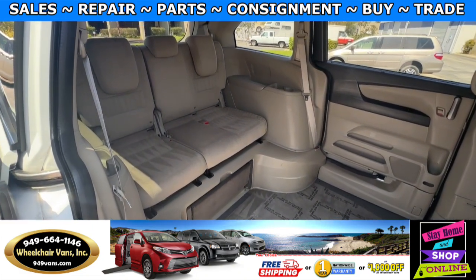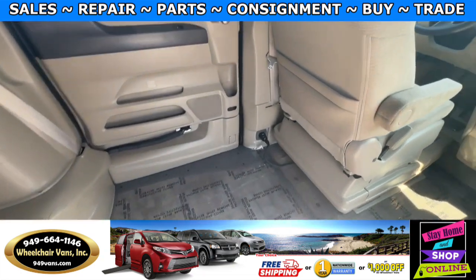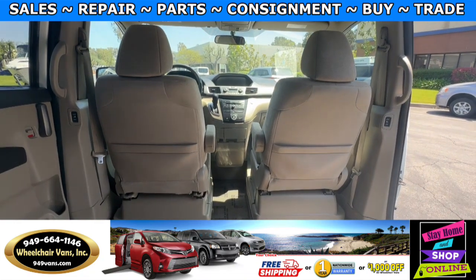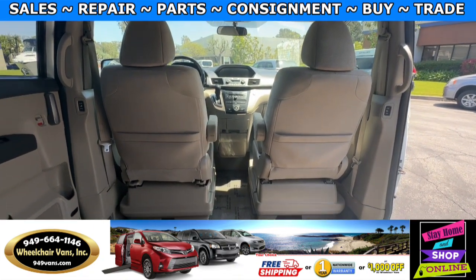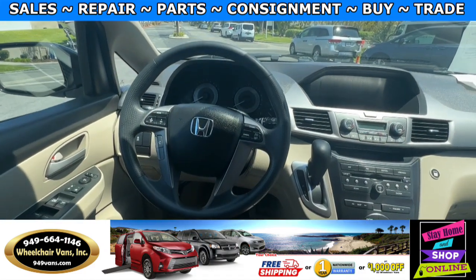Going to the back you will have a bench seat that will fit three people. And in the front you will have driver and passenger front removable seats. This van only has 74,000 miles.